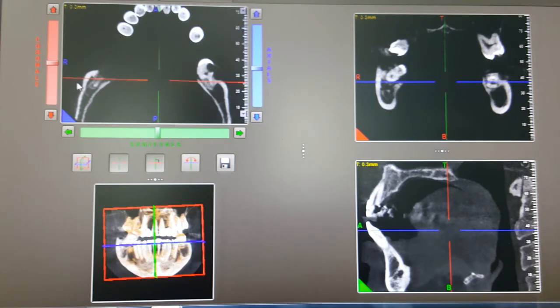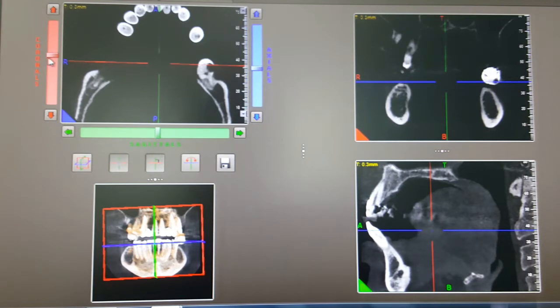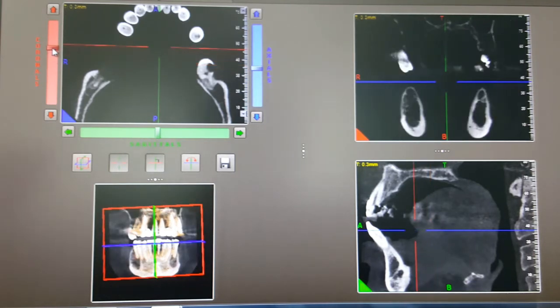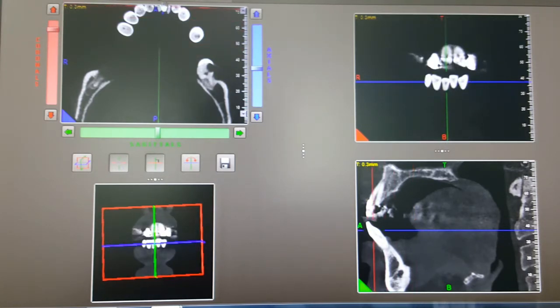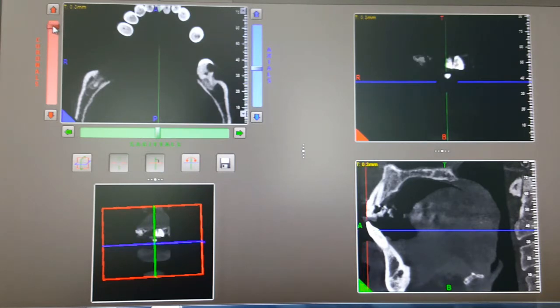Now we have to first understand what coronal, axial, and sagittal mean. This is how you can change the coronal view — as you can see, the coronal view changes from here. In the axial view you can see it comes from front to back. So coronal means if you start from the front of the face and go to the back with slices, you get slices from front to back. You can view it here as well — this is the coronal view in slices.